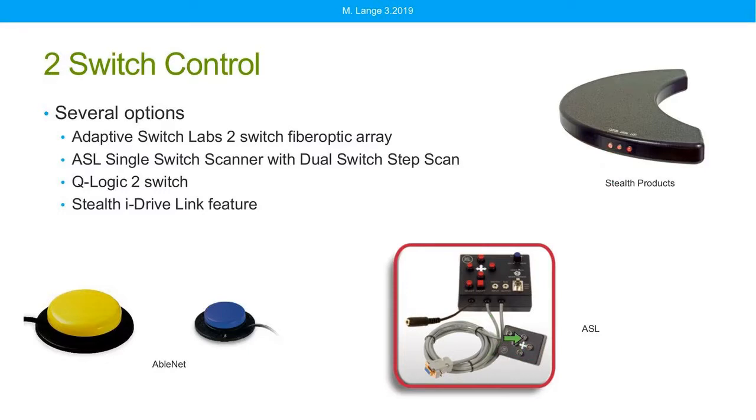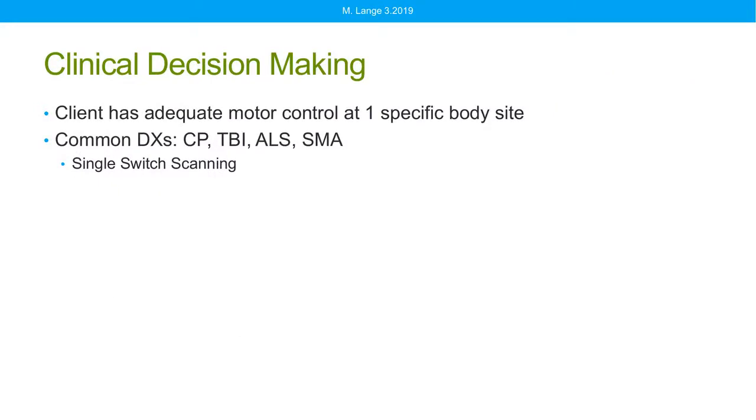When they got to the direction desired, they would hit their 2nd switch and hold it to move the chair in that direction for as long as switch contact is sustained. You could guess any of these methods are a bit tedious to use, but it does provide some options for people who can only control 2 switches.